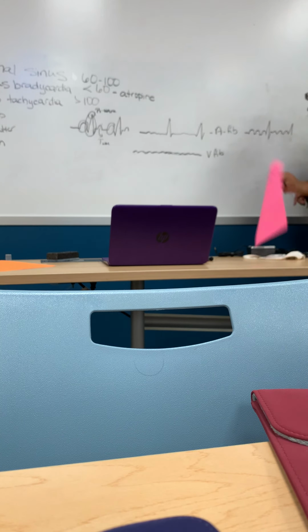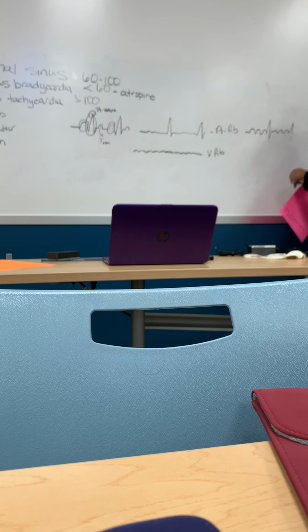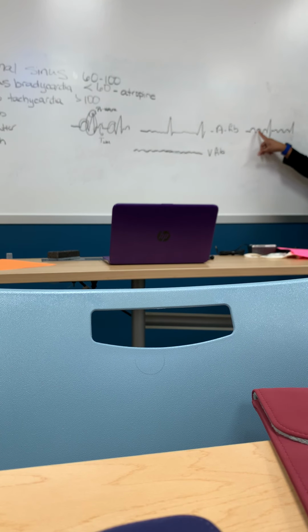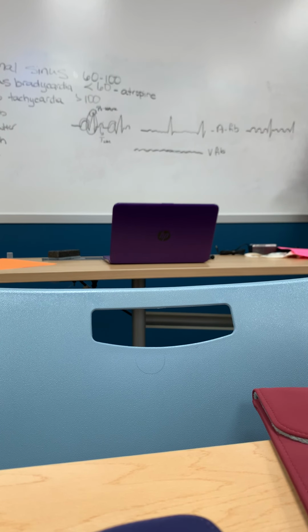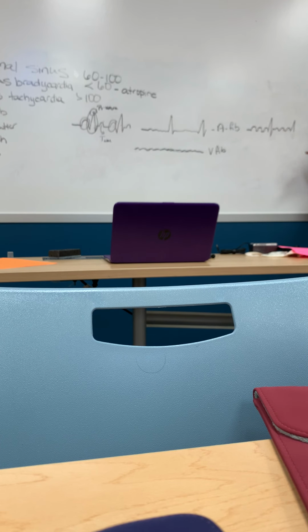If you can match them up, and they're the same, if you go all the way across, but you got more P's, your patient has a flutter. These are called flutter waves. And sometimes they say it's a sawtooth pattern. You can have either 2 beats, 3 beats, or 4 beats of flutter.